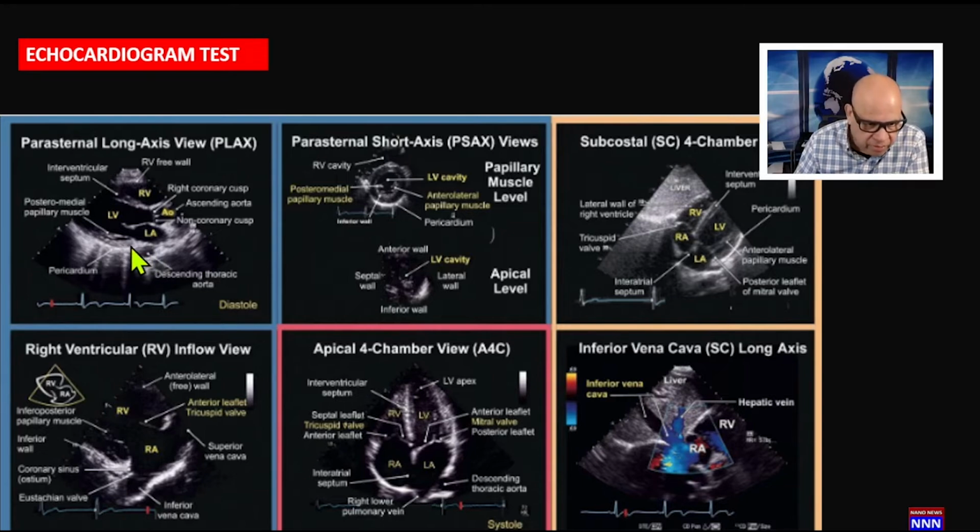And if you look at some darker shadow, that could be the coronary sinus. And if you get a pericardial effusion, it's going to be within the pericardial layer between the epicardium and the pericardium. Okay, so those are the structures we see here, and we could be seeing this in diastole or systole depending upon when the frame was obtained.